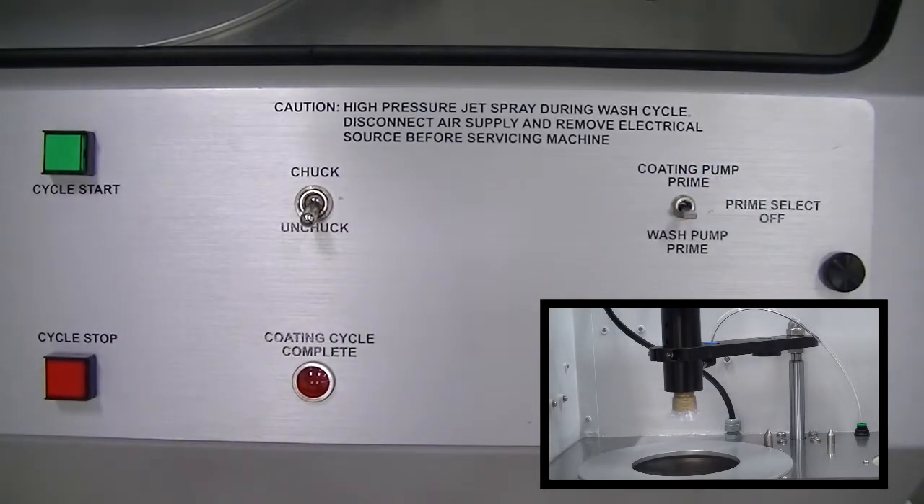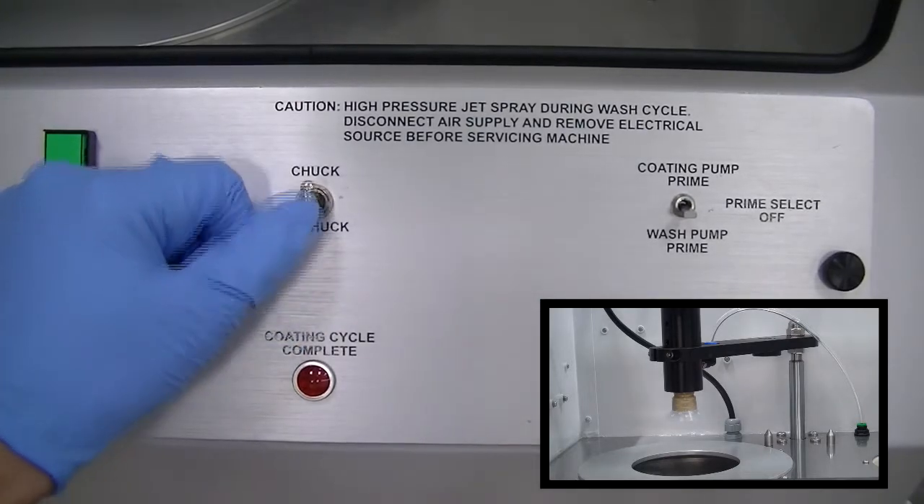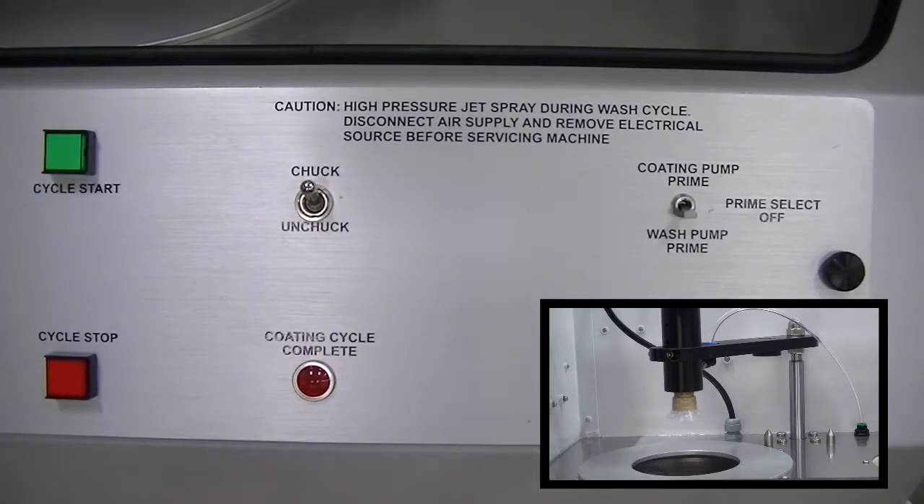Flip prime switch down to wash prime position. Flip chuck switch up to chuck position. Chuck an uncoated sample lens onto the suction cup. Press green cycle start button.